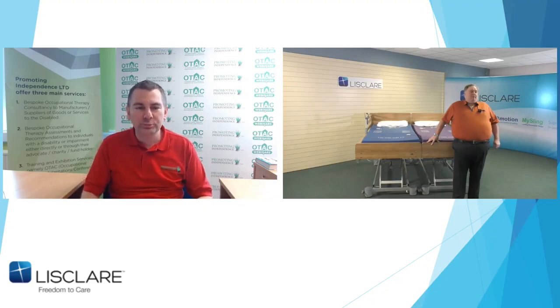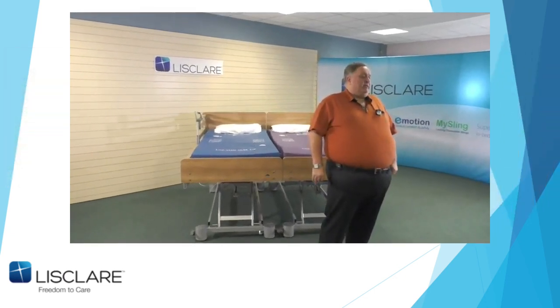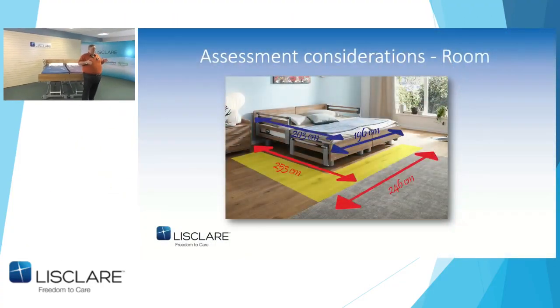Keith, can you just run through the footprint again, if possible? As you can see, there's the actual size of the bed, and then the actual size of the footprint, allowing half a metre to move the beds apart. Obviously, you'd have to consider mobile hoist space. This is just so it enables a care worker to get either side of the bed so they can do manual handling. I've actually done this type of bed in the past, about 15 to 20 years ago, and usually it's in a long-term client with an overhead hoist, but it works very well with a mobile hoist, and it's not a heavy bed to move.